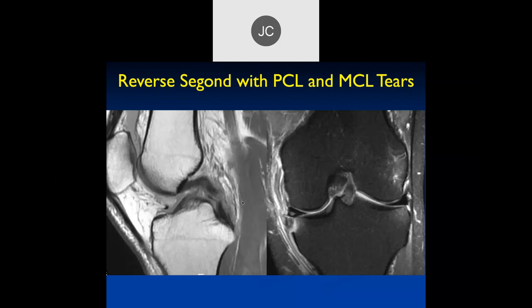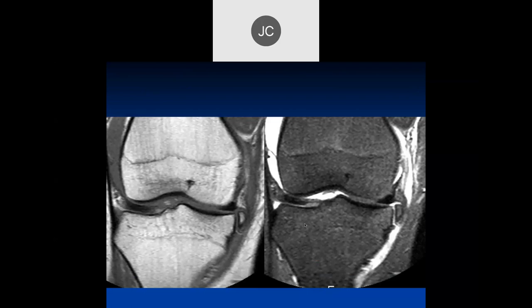I've seen them on plain films in the old days. Usually this has to be a pretty significant impact - probably a motorcycle accident or something like that. So this is an acute reverse Segond fracture. And this one looks like there is a non-union of that reverse Segond - it's corticated, so this is a chronic reverse Segond fracture.